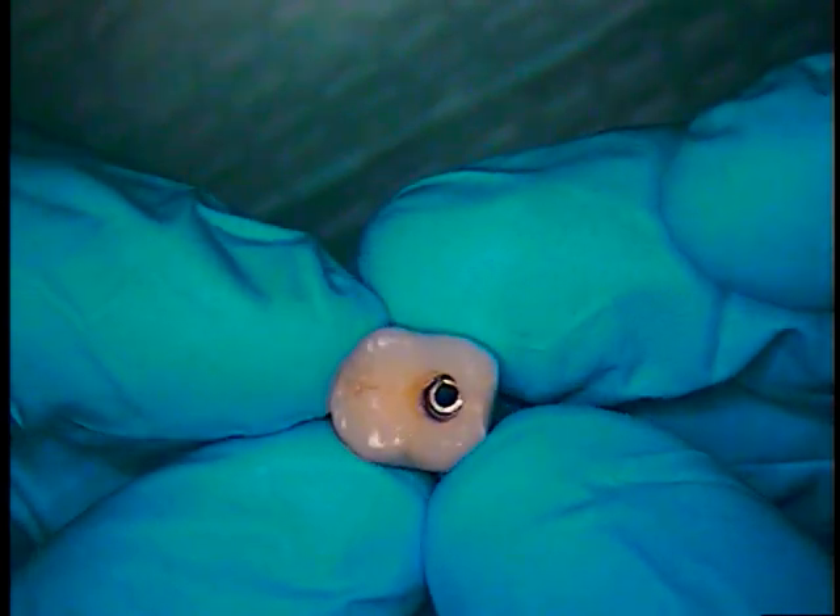We're setting that aside — obviously we're not going to put any of the original parts back in. This is the crown, and if you look at the axis, this is the distal aspect. You can almost see how this might have hung up the shaft itself, the way the axis hole was created. That caused the driver to go in on an angle and never be able to tighten it properly — that's one of my theories. You can see this is all undercut on the distal aspect, and this is all the mesial. So it's a cantilever kind of crown, and forces on one end can cause the other to teeter as well.